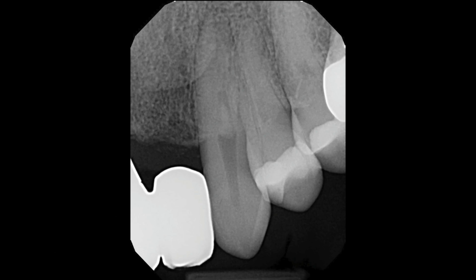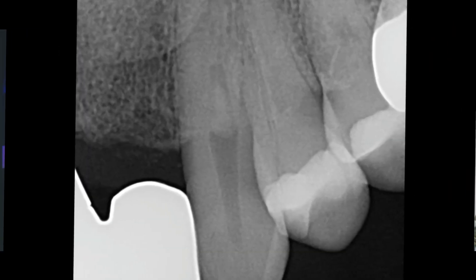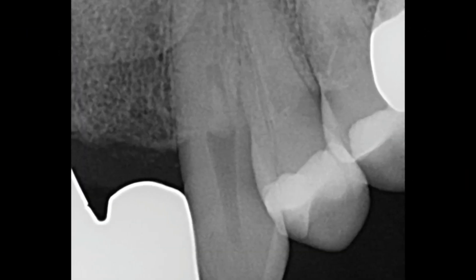The case I'm going to talk about is this canine tooth of a patient who came to see me. The tooth had been necrotic, changed color, was non-responsive, and had been really sensitive for a while, but the pain suddenly went away. From testing, it was showing the tooth was necrotic — not responding to any thermal stimulus. You can see a significantly large pulp stone or calcification in the middle of the pulp, which is something you see oftentimes with chronic inflammation. In this case, my assumption is that there was some recession causing chronic cervical irritation.